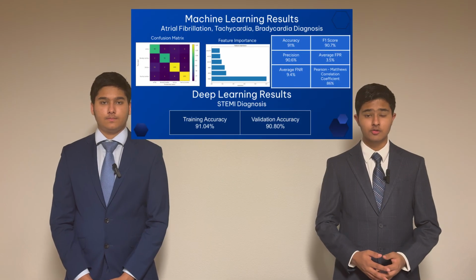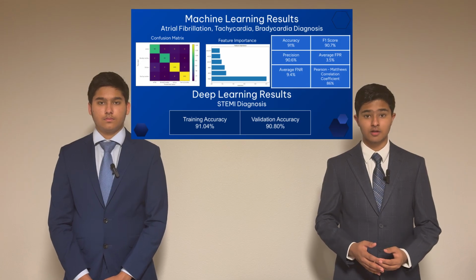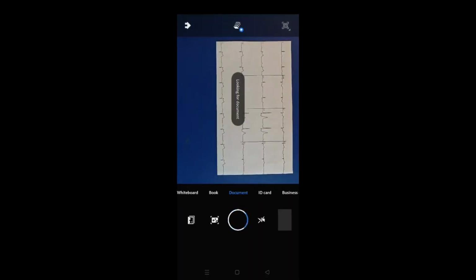Both these machine learning models saw an accuracy of over 90%, significantly surpassing current clinical standards. We integrated all of these features into an amazing web application.